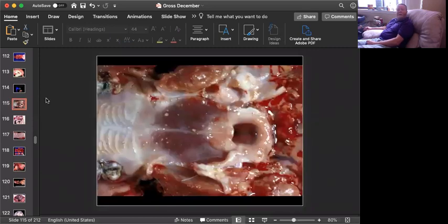And slide number 1 is tissue from a pig. Can you give me a morphologic diagnosis and 3 possible causes?